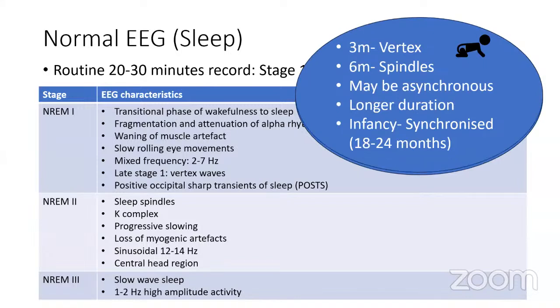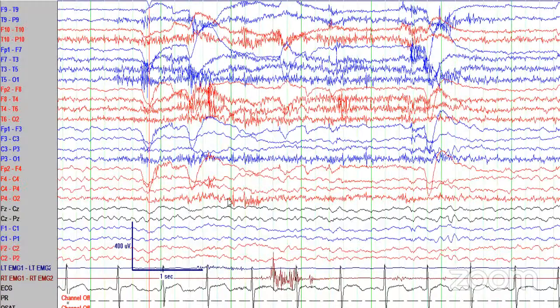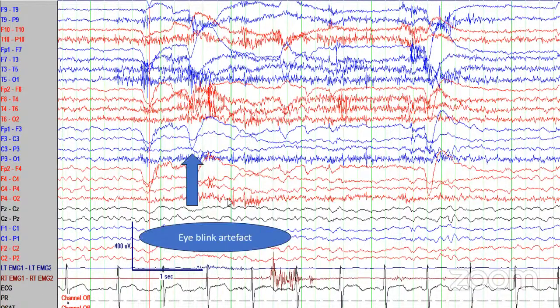So with some examples, let's see the transition. Here again, I have put in 2 examples, one of the girl with that asymmetrical PDR and another a perfectly normal EEG. Here, this is an awake record. How do we know it? We have the muscle artifacts, plus we have these eye blink artifacts. This person is awake, blinking frequently, tensing his or her muscles, and we have all these artifacts. So this was eye blink, and these are the muscle artifacts.